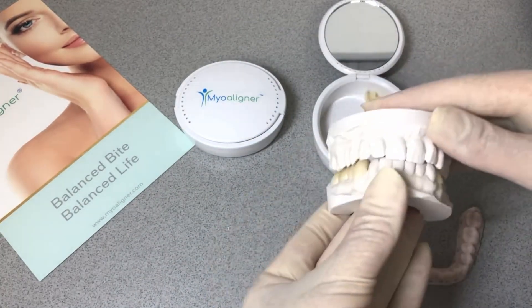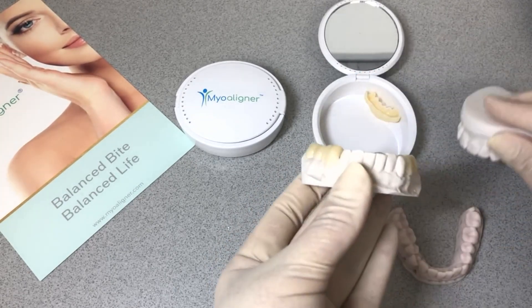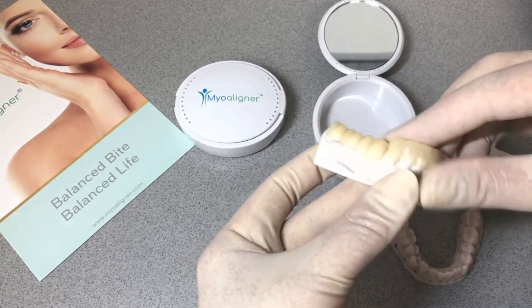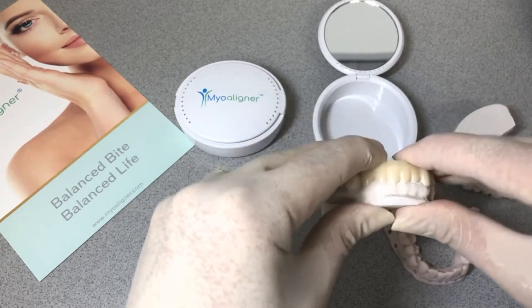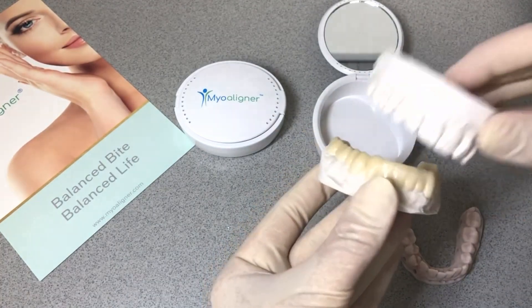If the vertical dimension of occlusion is open, we make an anterior segment also to provide some anterior guidance, canine guidance, and this allows the patient to be able to chew and function really comfortably.